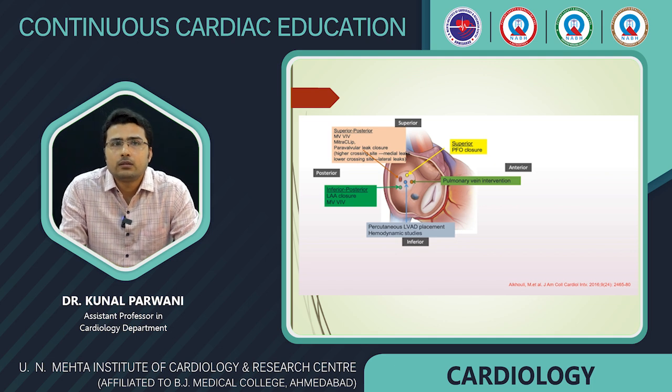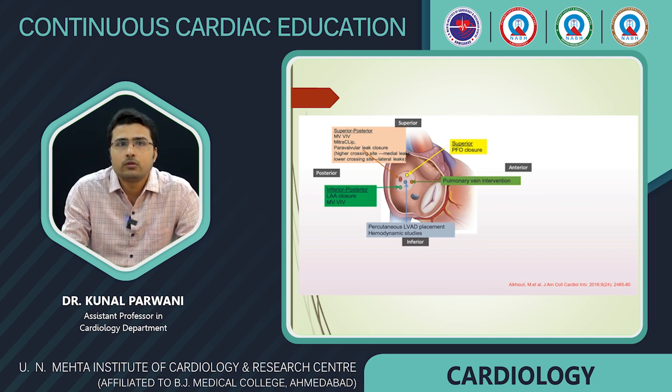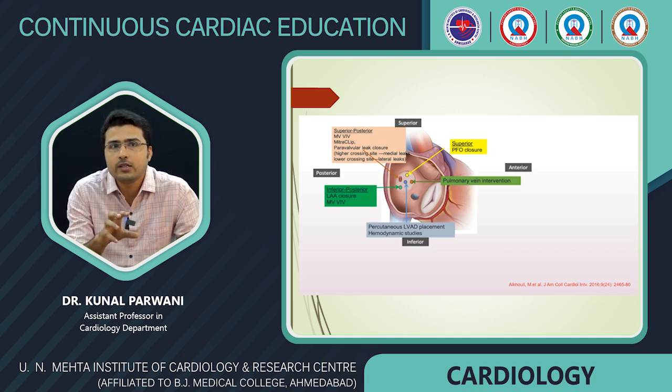These are the various indications and various sites of the transseptal puncture that can be of use. As you can see in this, for the various positions of the fossa ovalis and the location of the transseptal puncture required to perform those procedures.